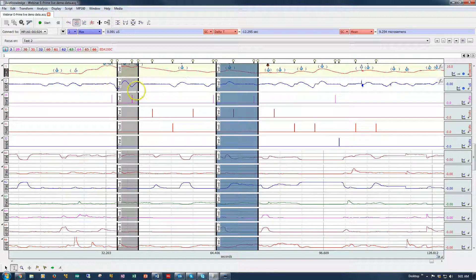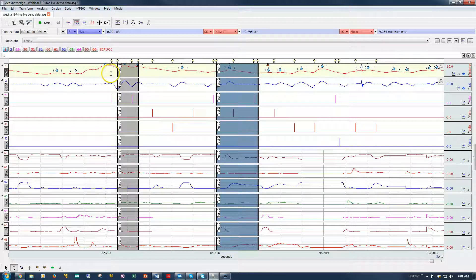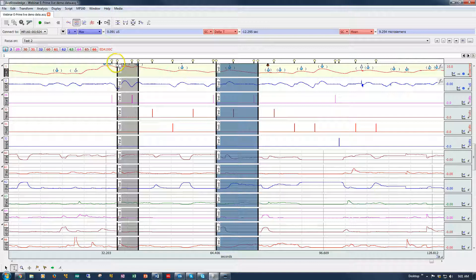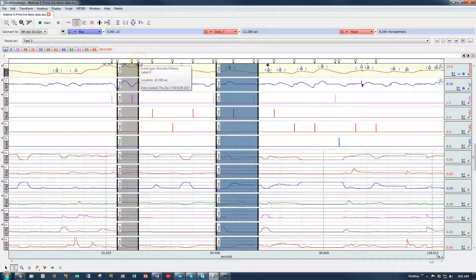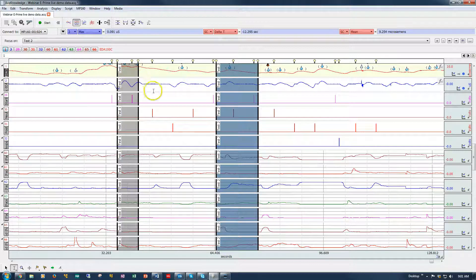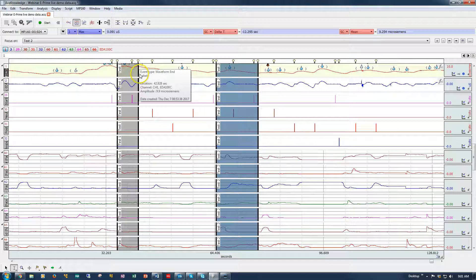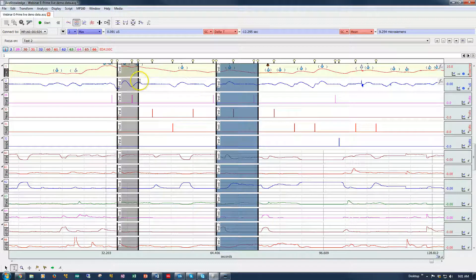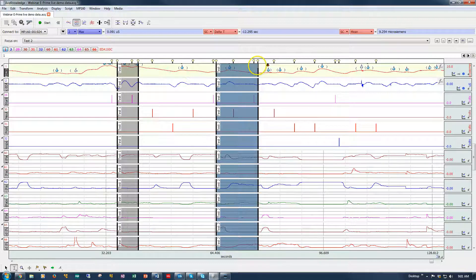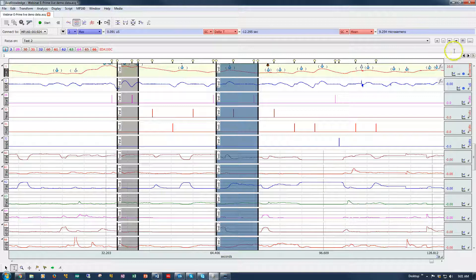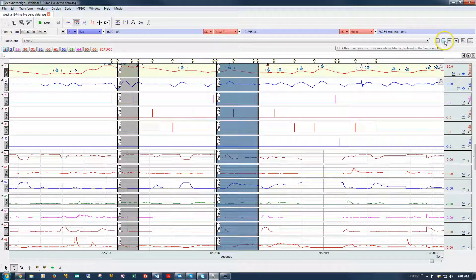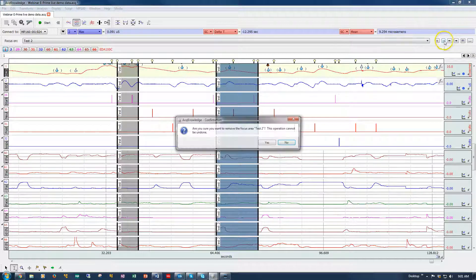We can see these are unique ones. We've basically gone from the first 8 to the second 8. We've instructed the system not to go from this 8 to use it as a beginning boundary. We've found the next 8 and then the next one. So that's one way.